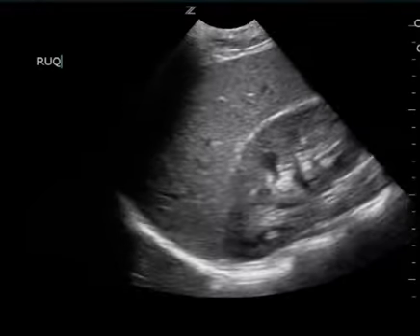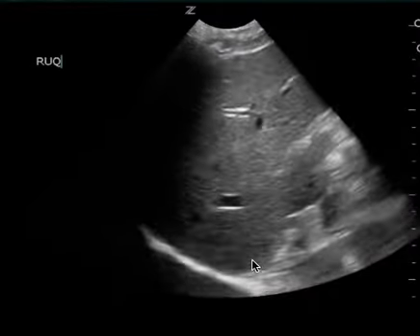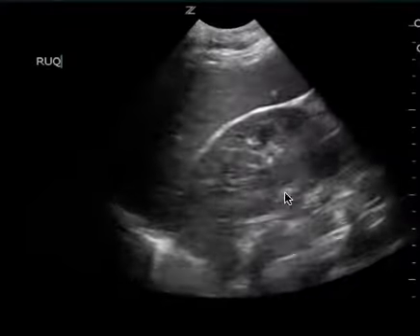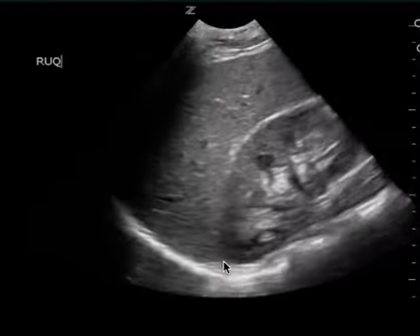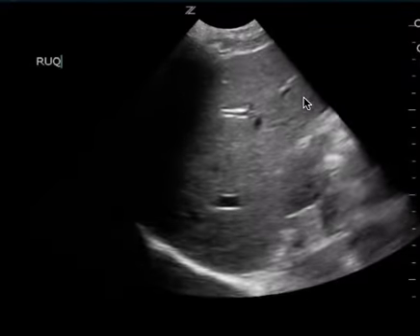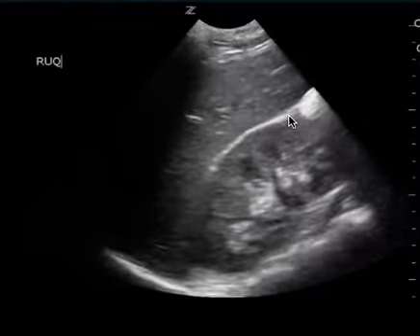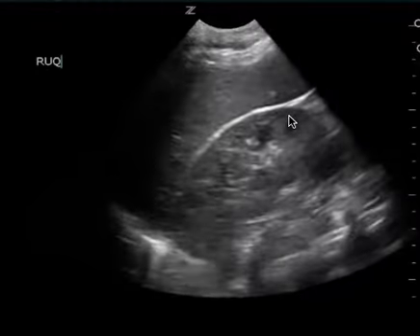This is a FAST exam on a different patient, but I want you to focus on how the provider is moving the probe. You really get a good view of the 3D structure — here is Morrison's pouch. You see the diaphragm come into view, the spine. You can see the inferior pole of the kidney, the edge of the liver. This is what I'm looking for. I want you to be able to move the probe and save a clip so that I can see the whole 3D structure.